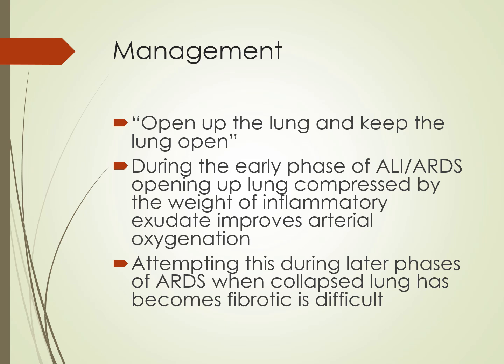All of these strategies use the open lung ventilation strategy. In regard to recruitment maneuvers in ARDS, this is a great way of actually opening the lungs, followed up by high PEEP, and my next few slides will talk more about that. So I wanted to talk about some of the potential benefits of the open lung ventilation strategy in ARDS.